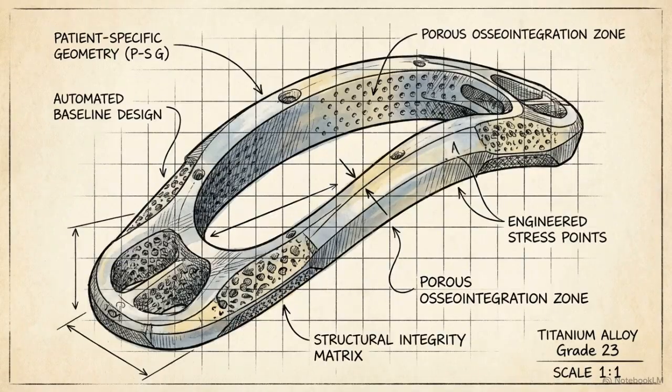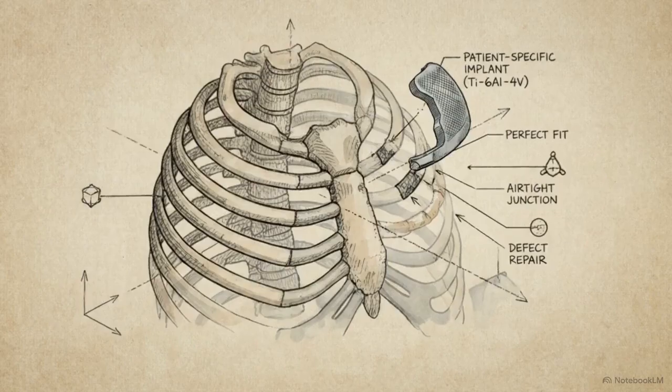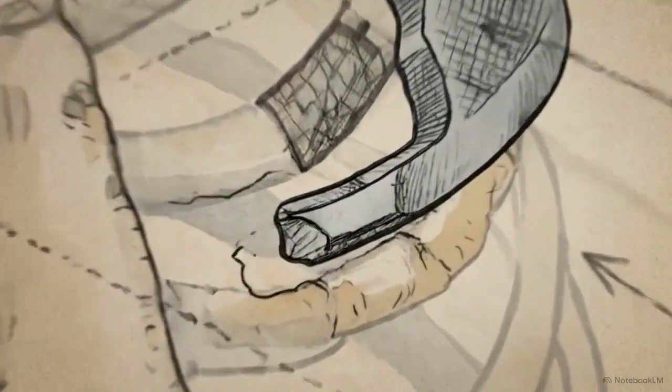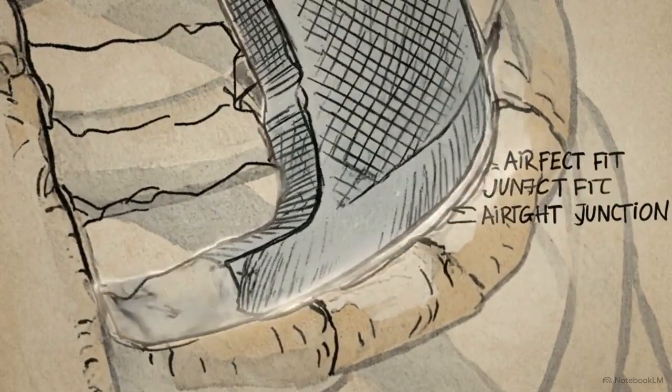However, RibCageImp successfully establishes the first fully automated baseline for data-driven thoracic reconstruction. It proves that deep learning can bypass hours of manual CAD labor to generate functional, patient-specific chest implants directly from medical imaging.